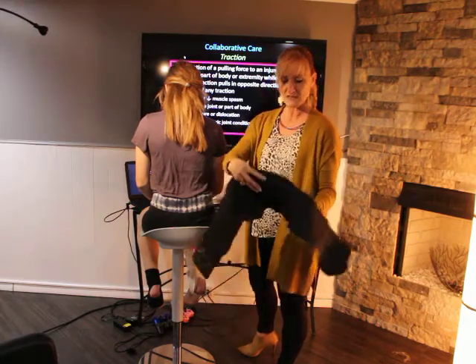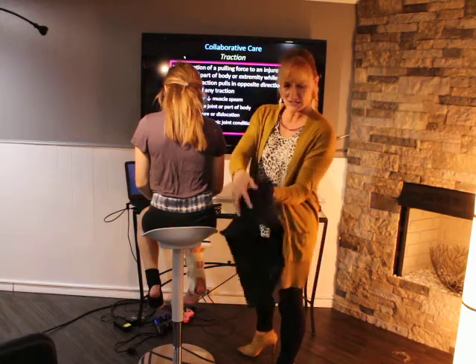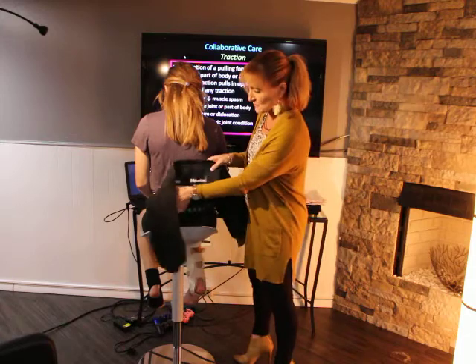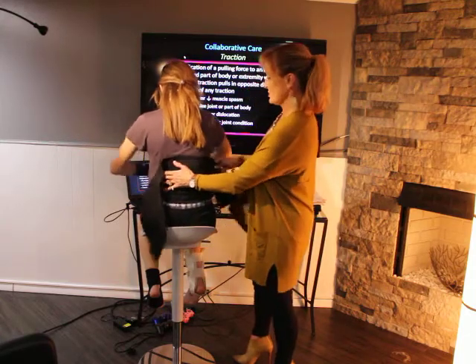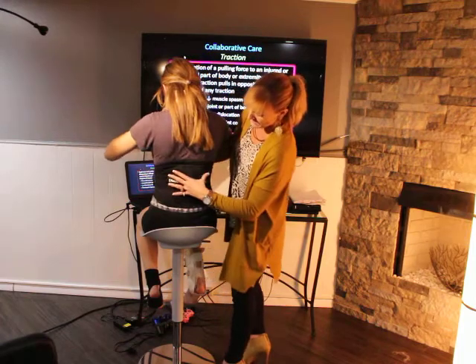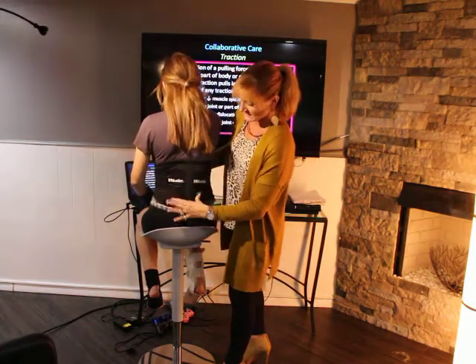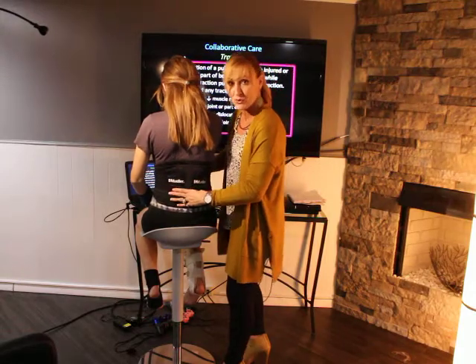And you'll notice in these, this is a back brace, there is a cushion here like this. You're going to want to put that right in the small of the back. And then you're going to wrap this around your patient. And now, see how before I turn her around, see how this is solid in there? That's going to give these muscles a lot of support.